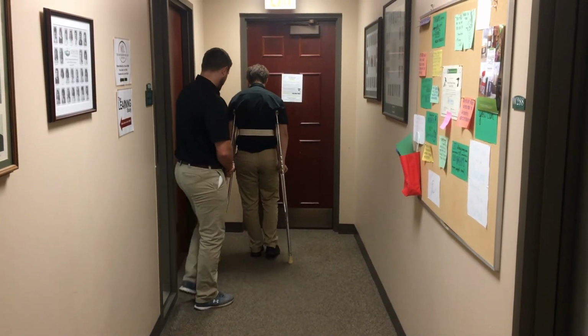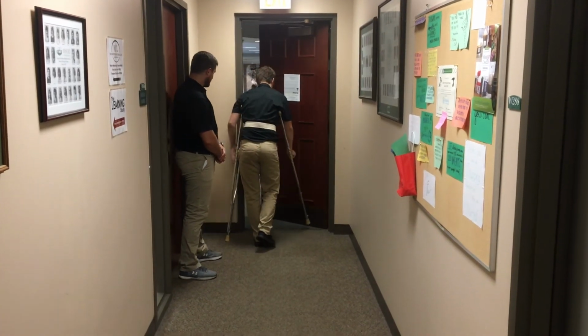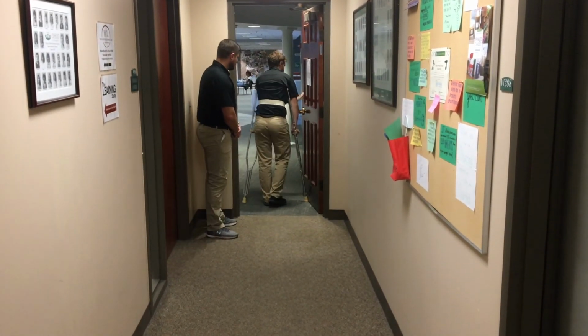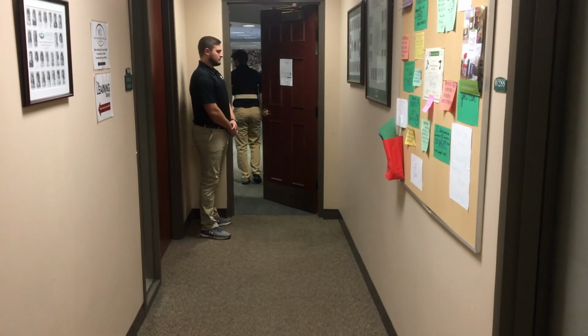Instruct the patient to stand directly in front of the door and have the patient shift the weight to the crutch opposite of the hand closest to the door handle. With their free hand, the patient will push the door open wider than the width of the patient and the crutches. The patient will quickly return their hand to the crutch and use the crutch closest to the door as the doorstop. The patient will then repeat this process to move the door open wider and progressively move the doorstop crutch towards the handle side of the door. The patient may use one final push when the crutch tip nears the end of the door in order to avoid the door's swing arc.